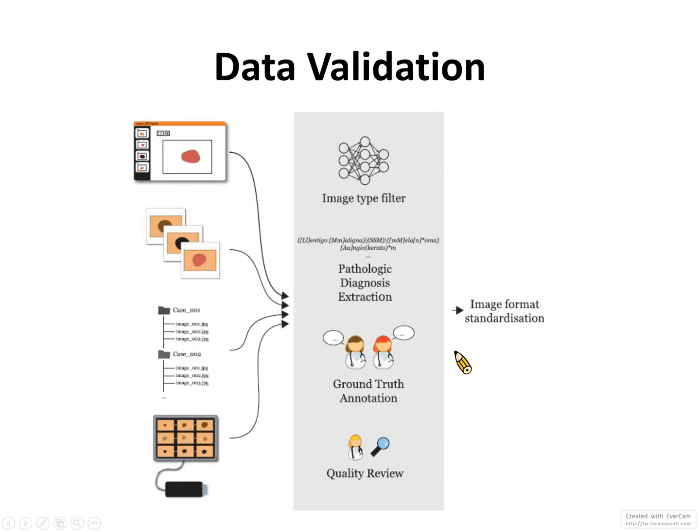So in this database, the providers of this image database did lots of very good work to validate these images. Usually these dermatoscopic images came from different hospitals and different sources, and they were taken in different conditions, for example, different environmental light, or maybe different resolutions.